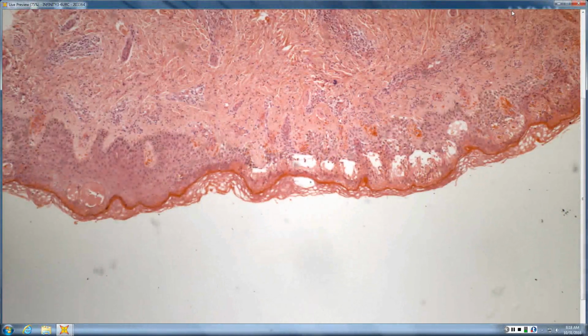This one actually is a biopsy from someone with HSP who had some epidermal necrosis just because it was a long-standing, pretty bad vasculitis. But histologically, bug bite would be higher for me because of the epithelial change. So I would have gone exactly where you did.